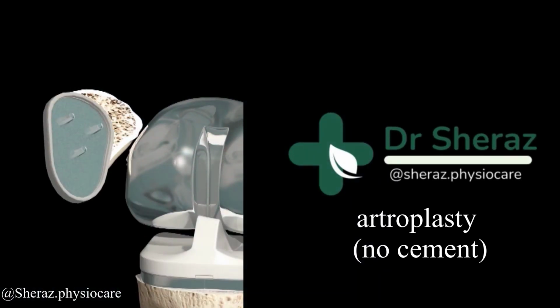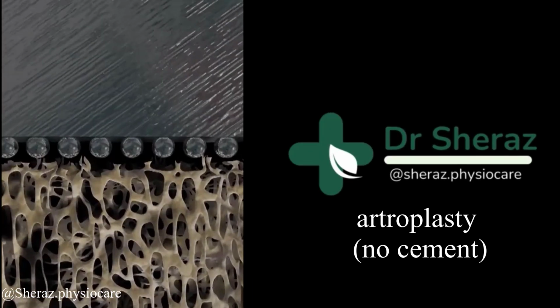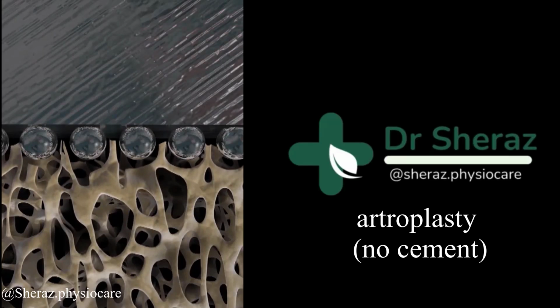This operation results in pain-free movements and return to the normal ranges of knee joint movement.